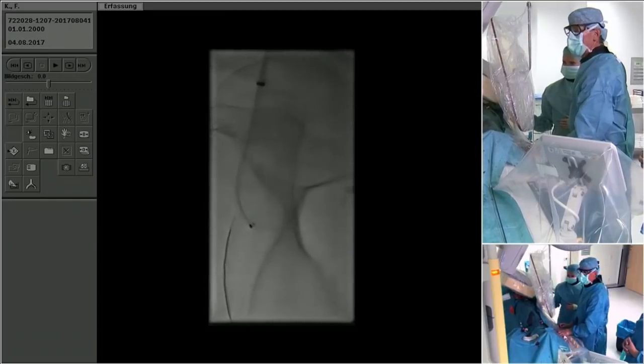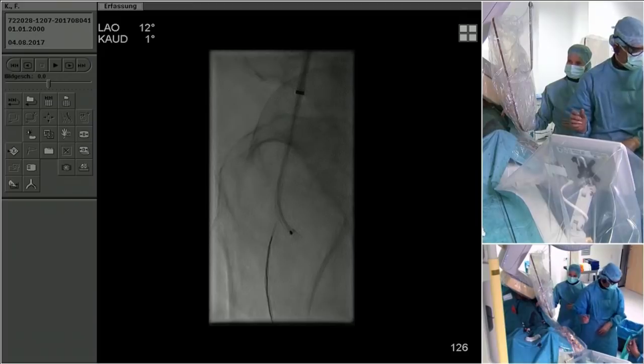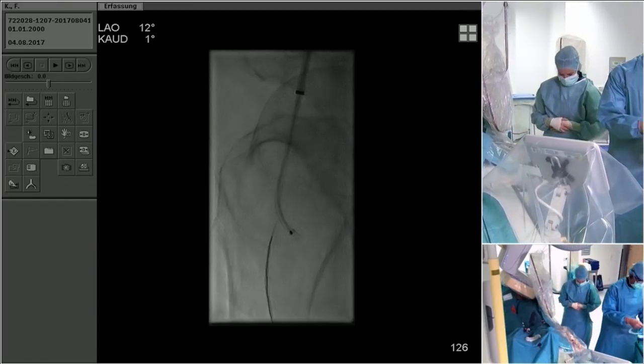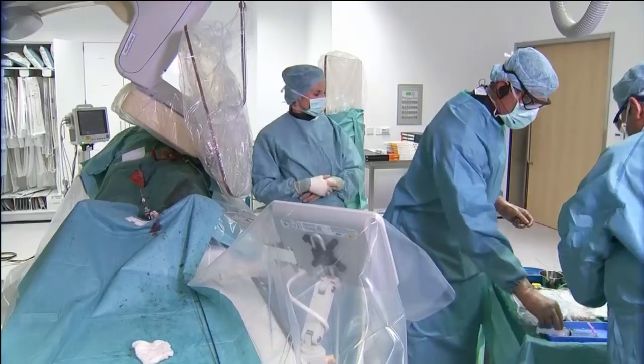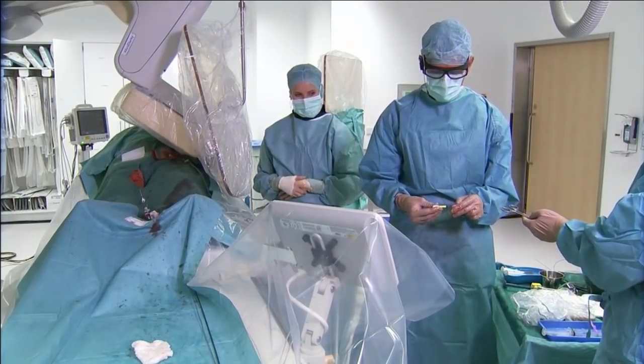And in fact, as I said, that needle is not really very stiff and pokey and sharp at the end. I take an 014 wire and take the back end and give a little angle into the back end with the clamp and then drill the wire through. Which wire are you picking here?